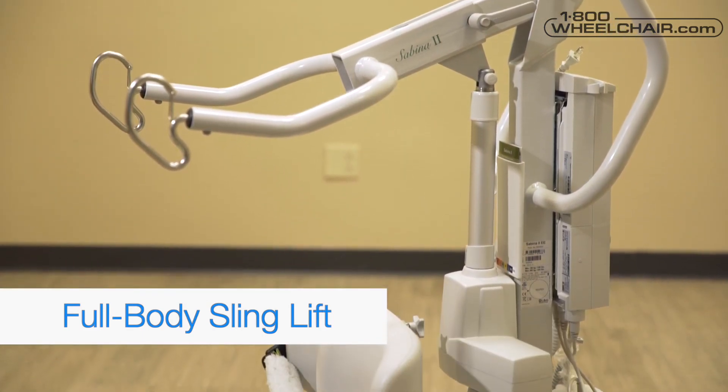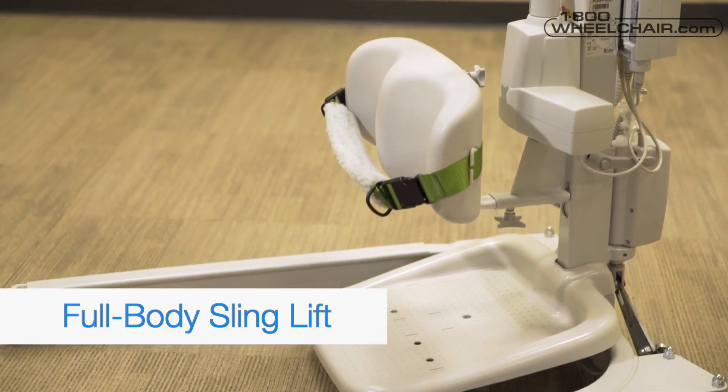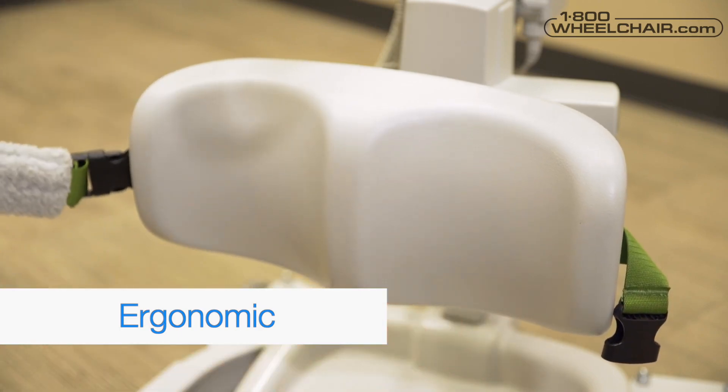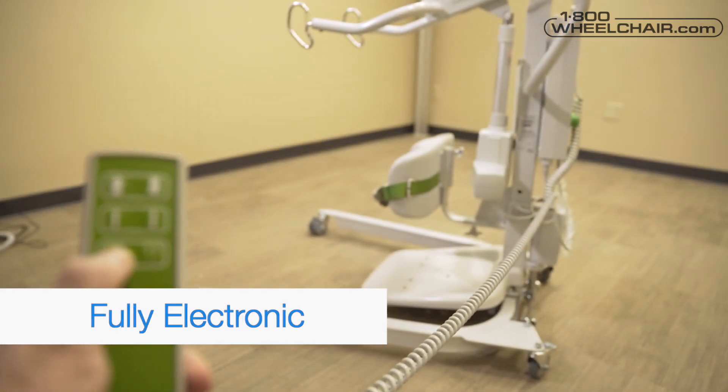If their condition worsens and the patient is unable to stand, the Sabina 2 can be used as a full-body sling lift. Ergonomic: the Sabina 2 is comfortable and ergonomic and has a very smooth raising motion.